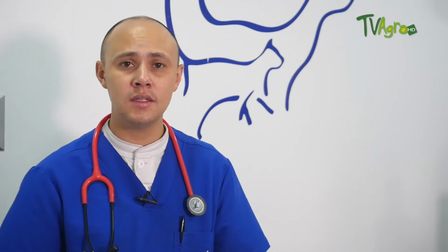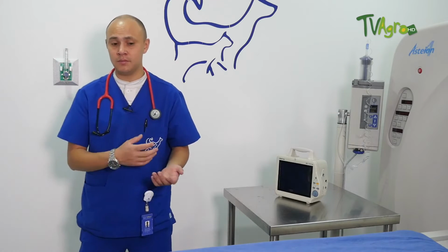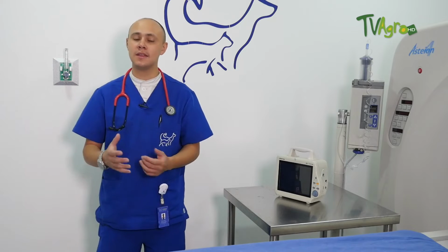And the other would be directly in the abdominal cavity. In the abdominal cavity, we can generate many diagnoses, which are very limited with other types of diagnostic tools. A very clear example could be a pancreatitis or neoplastic alterations at the level of the vessels, of the liver. We can also detect foreign bodies when we are not sure of the diagnosis if one should take the patient into surgery, and mainly neoplasms. Neoplasms are very important in the abdominal cavity, and we can determine them very specifically and exactly with this type of studies.